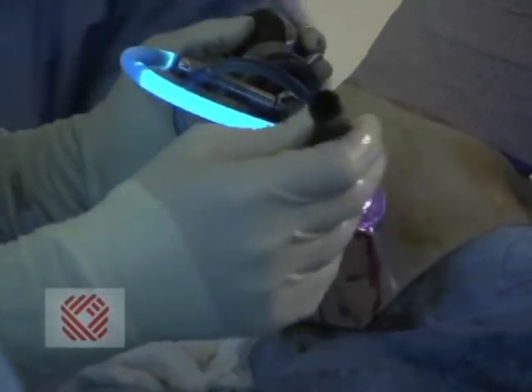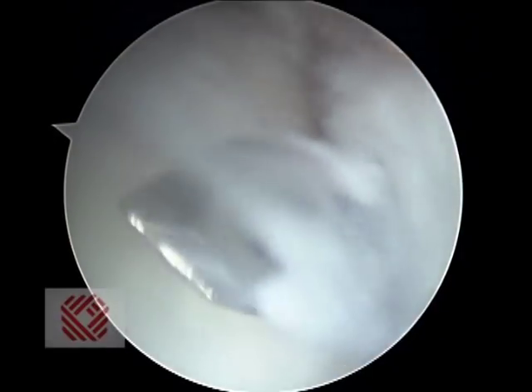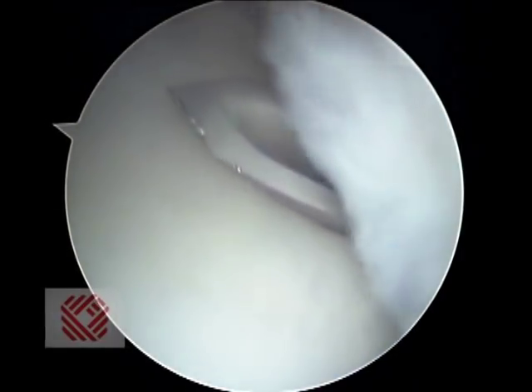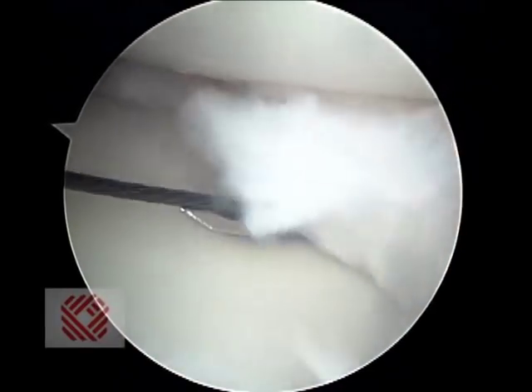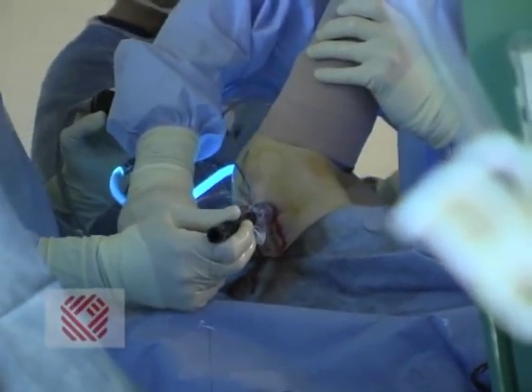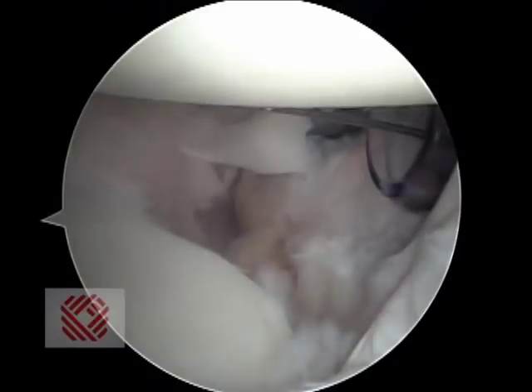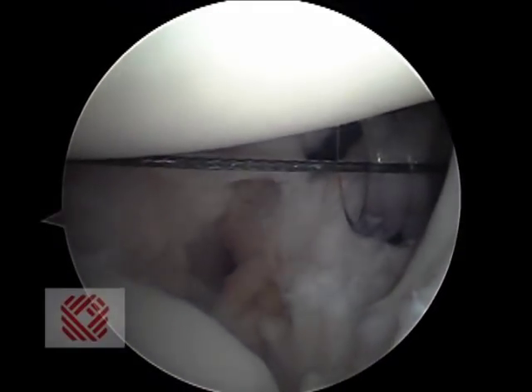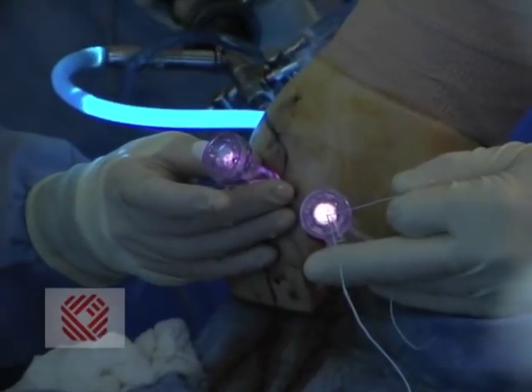This is a suture — we're passing our suture. This is not the suture we're going to tie with; this is the suture we are going to pass with. We're going to put our tying suture through this loop, and that's going to be the suture we use to tie.